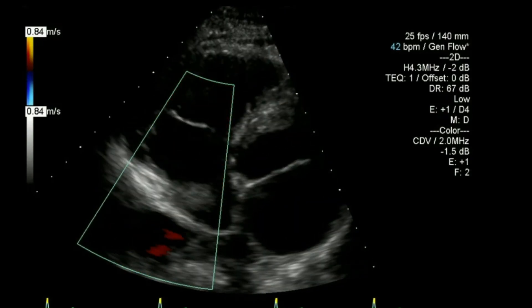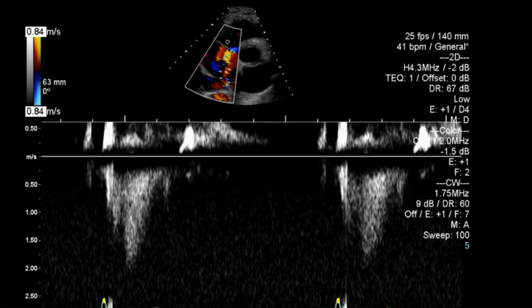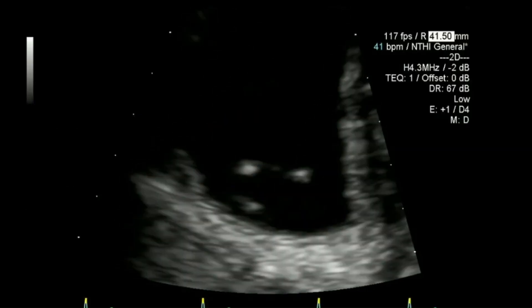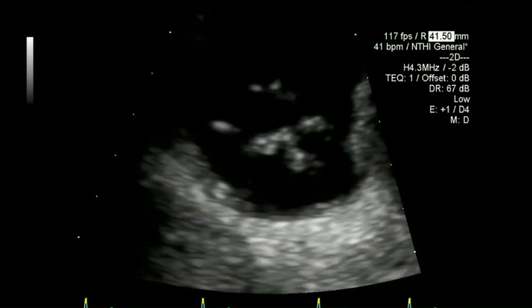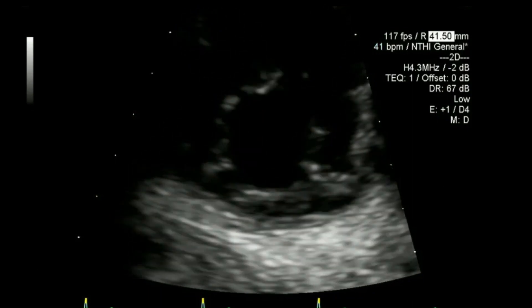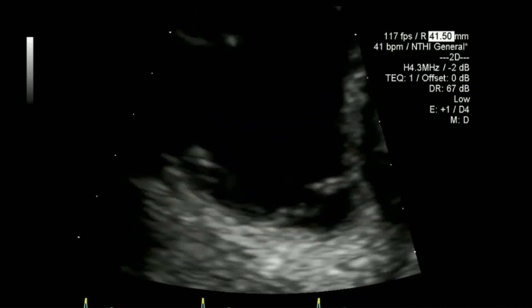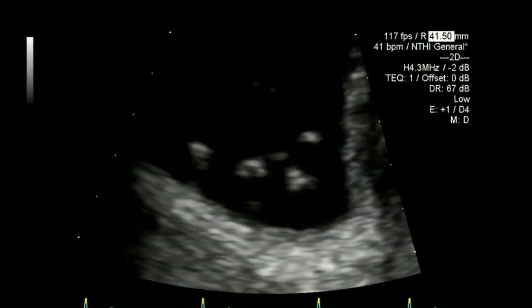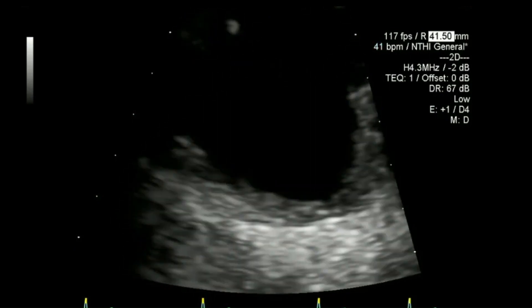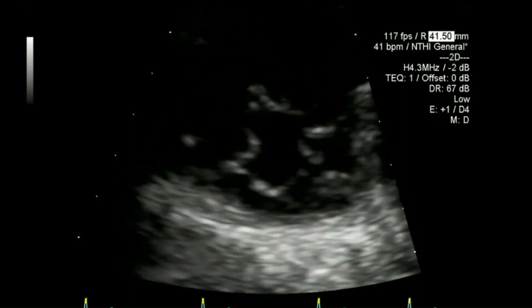I'll put colour flow on there and look at the Doppler again. I've taken a short axis of the tricuspid valve — on some patients you can open this up quite nicely. Even though it is considered a trileaflet valve, it can actually vary from two to five portions of that valve in truth.